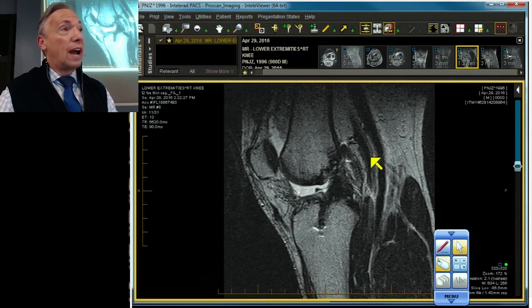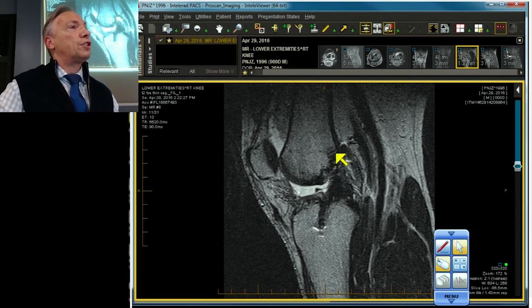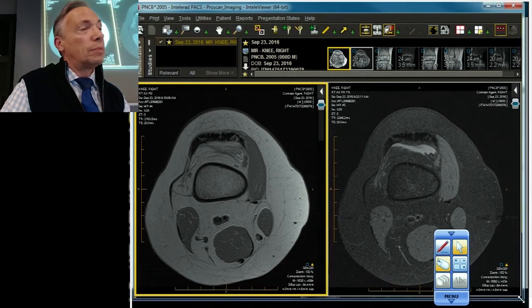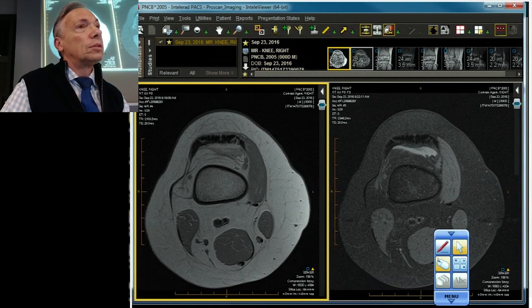This patient had a graft. The graft is attenuated proximally — in fact, it's torn as it enters the femur. This is an ACL deficient knee. They go together like soup and sandwich: bucket handle tear and ACL deficiency. Very common. Medial is more common — about 60/40.